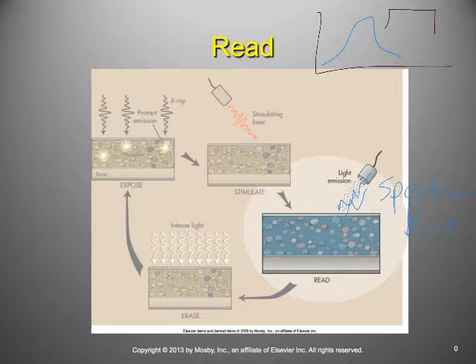That will increase noise, but it will also increase the signal, and that's what we're going to then digitize. Okay? So this part here, where it says light emission, really what we're doing is sampling it. We're taking this light, we're putting it through a photomultiplier tube, and then we're going to digitize that.